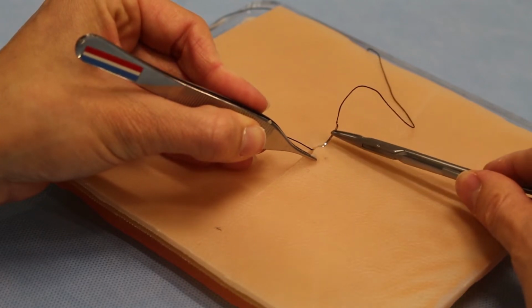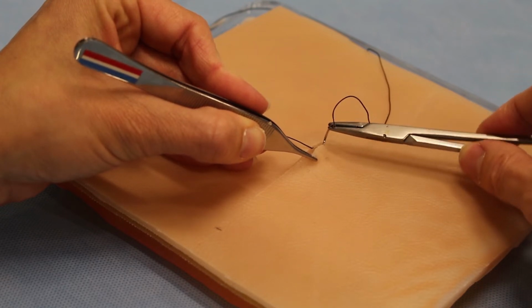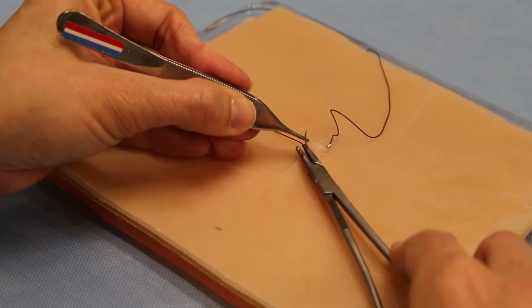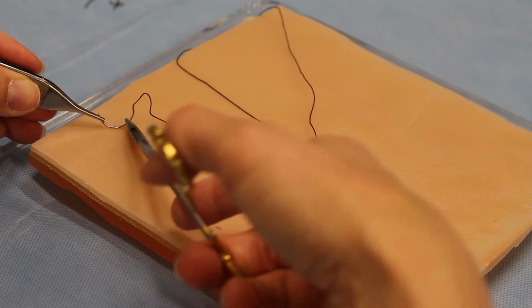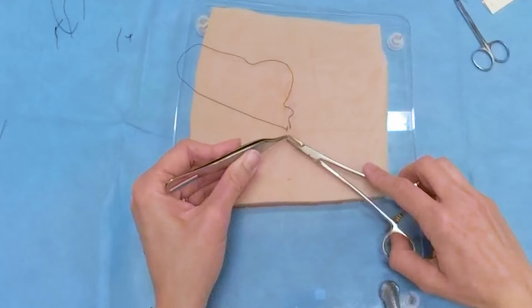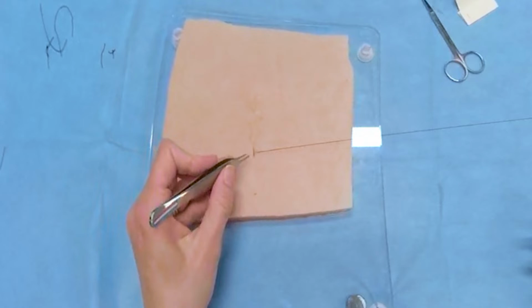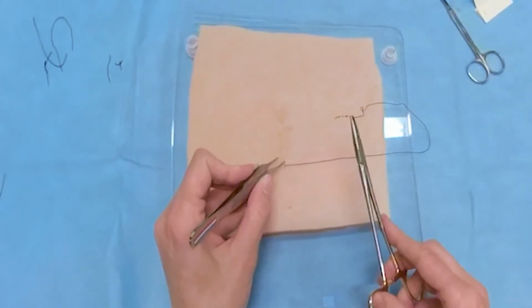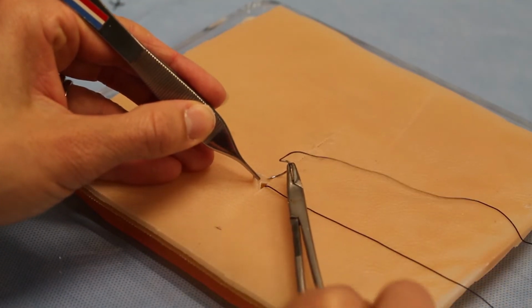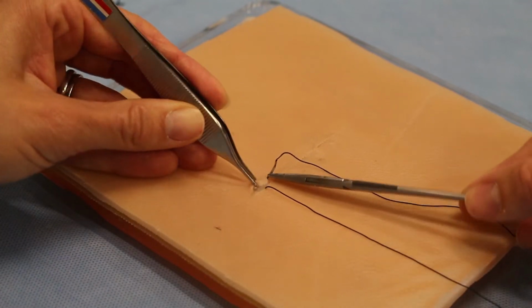Now what I see often is people want to do this, they want to skive. You want to try to get this to go in somewhat perpendicular, rotate so you actually get some tissue, come back out at the skin edge. As we approach the end, you're going to start thinking about when you need to tie your knot. So we still have a bit of incision on this side, so I think I have the ability to throw one more stitch on this side, and then I'll show you. So I'm going to try to do a little bit of a 90 degree, rotate out at the skin edge.